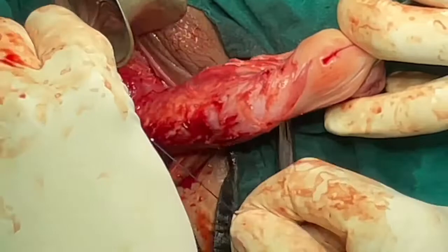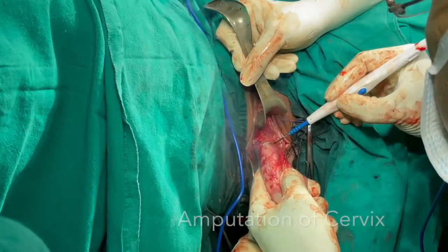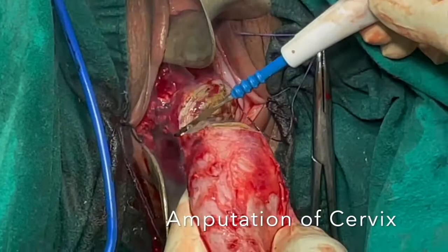This also minimizes the bleeding from the cervical stump. Using the cutting current, the cervical amputation is done. Remember that you are supposed to leave behind around 2.5 cm of the functioning cervical canal. In this case, we have removed nearly 5 cm of the elongated cervix.